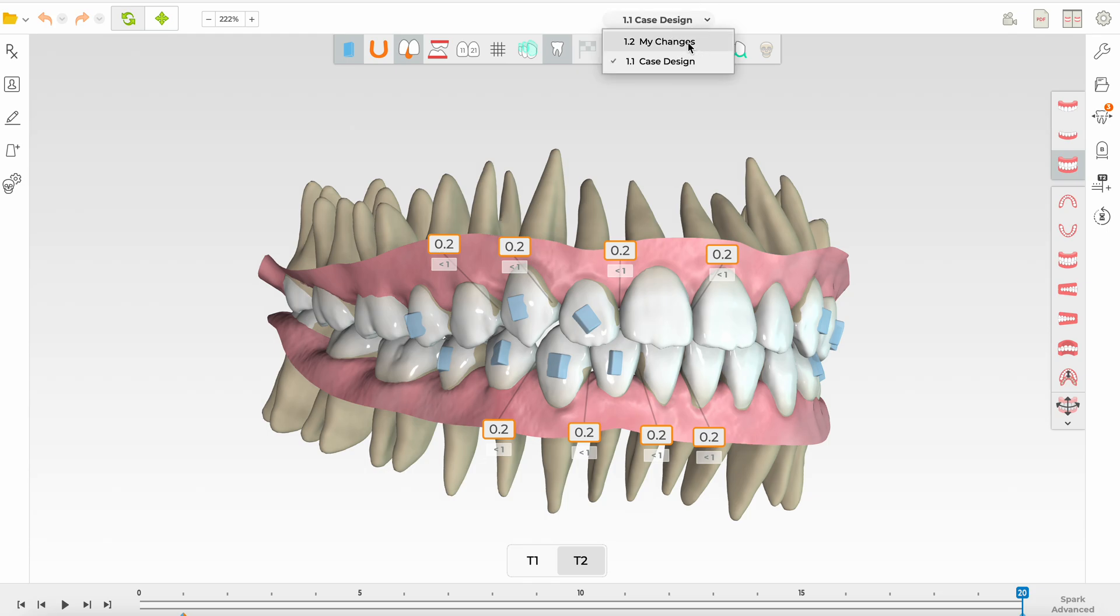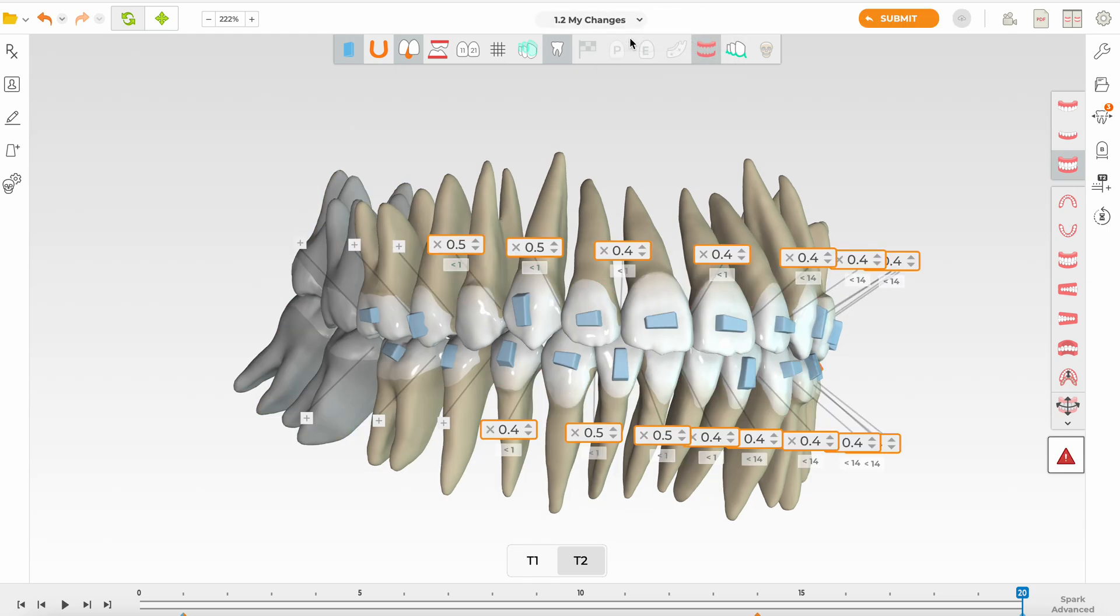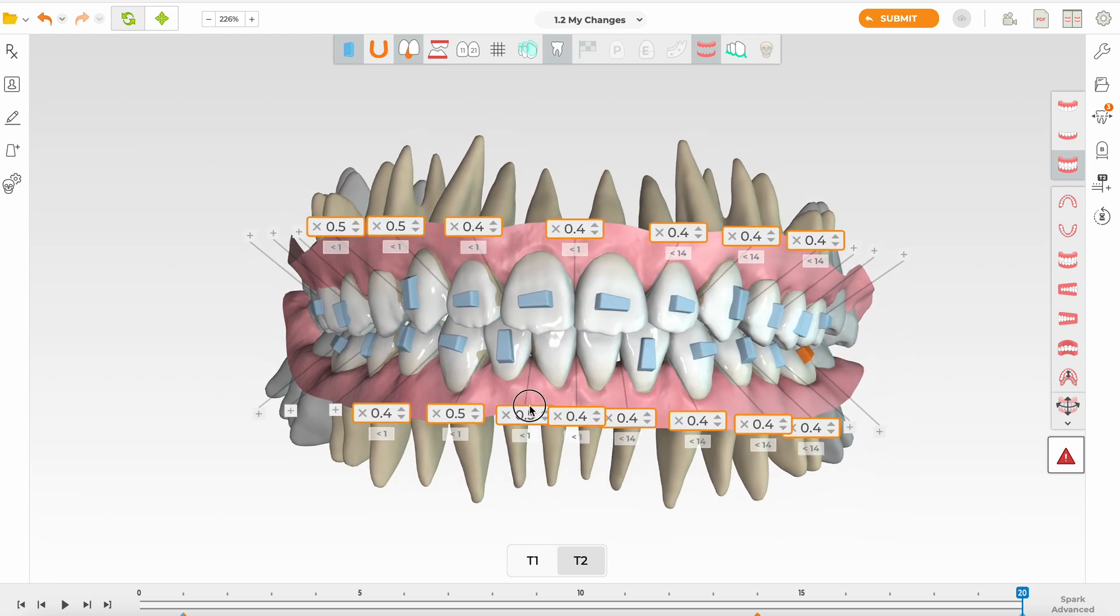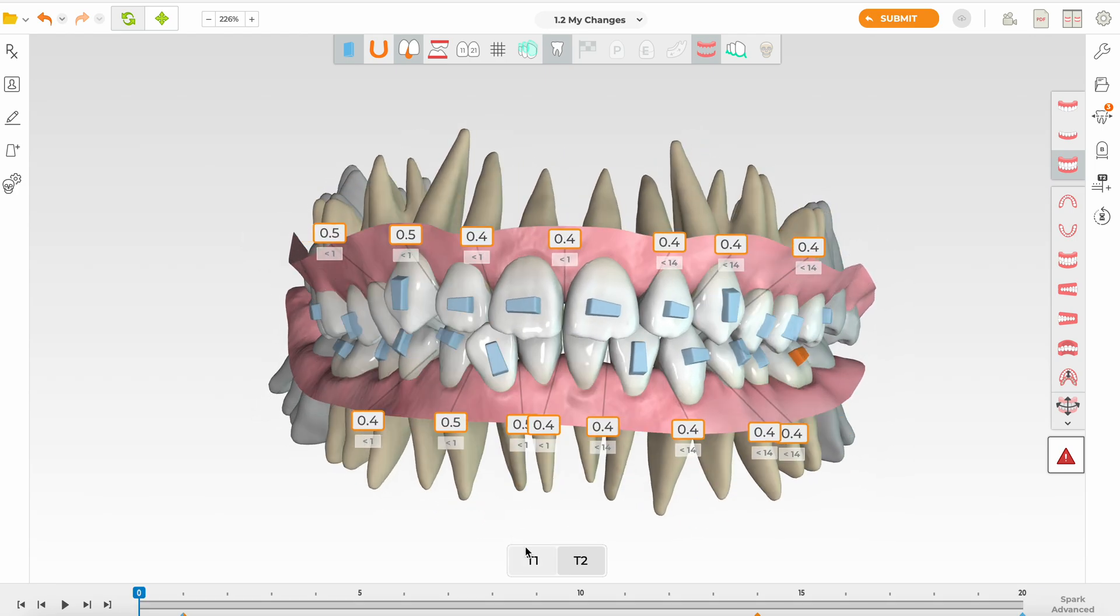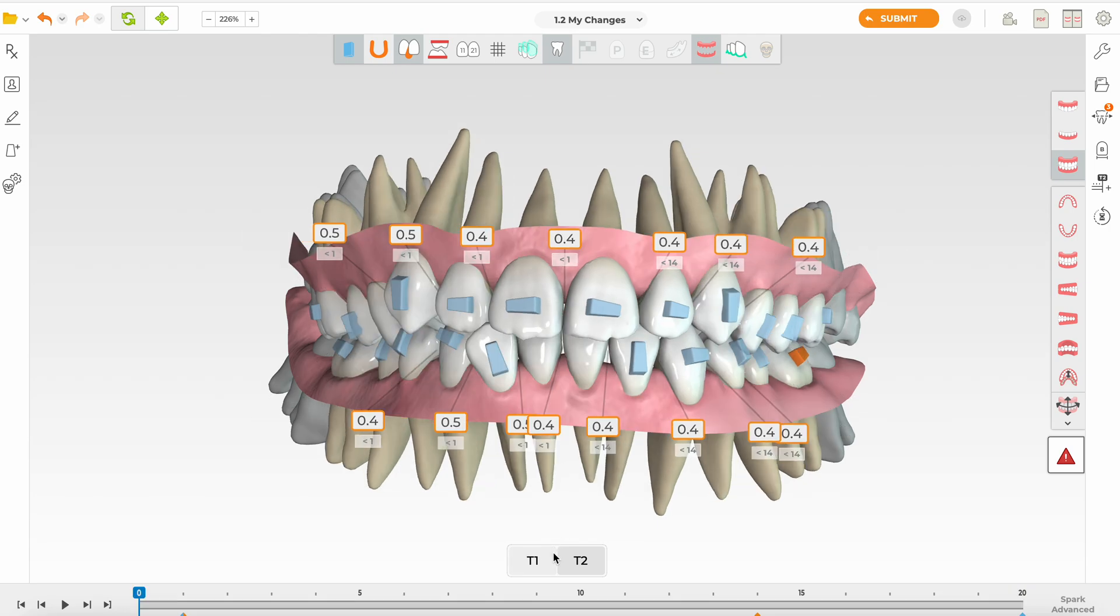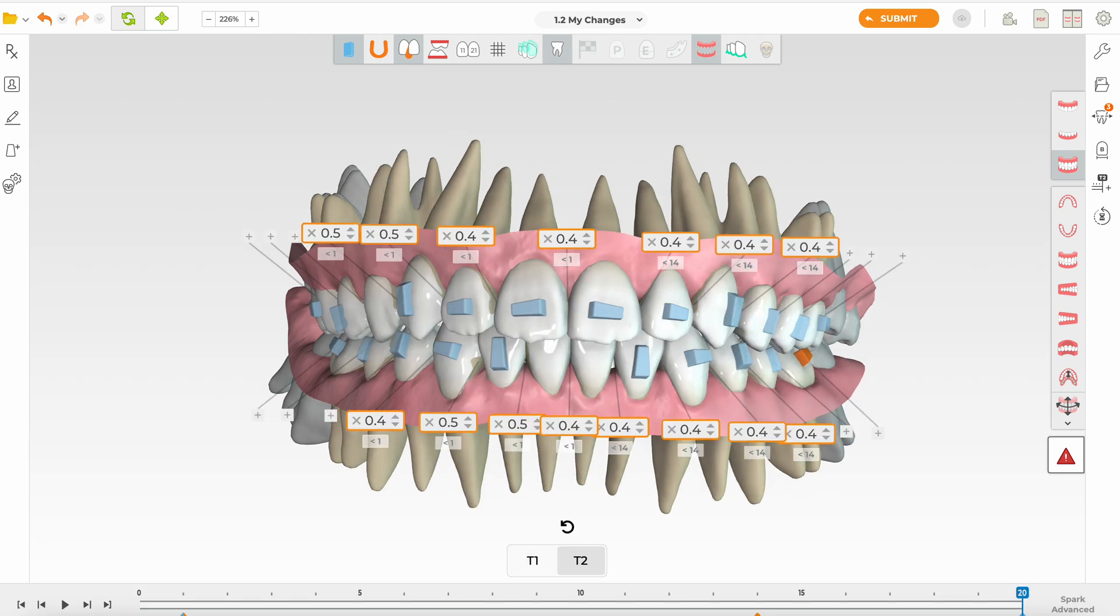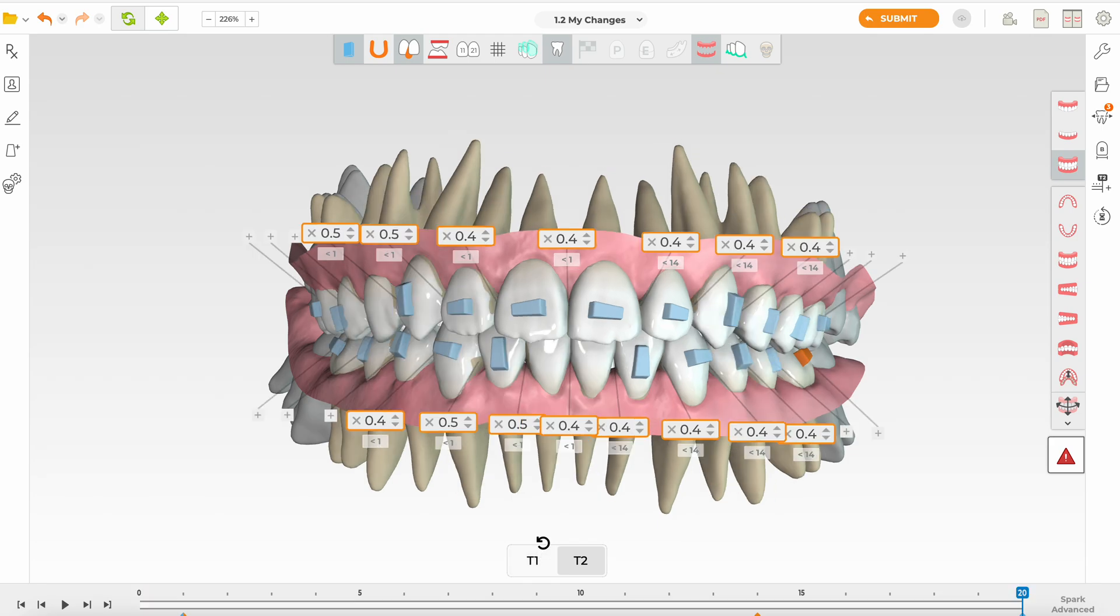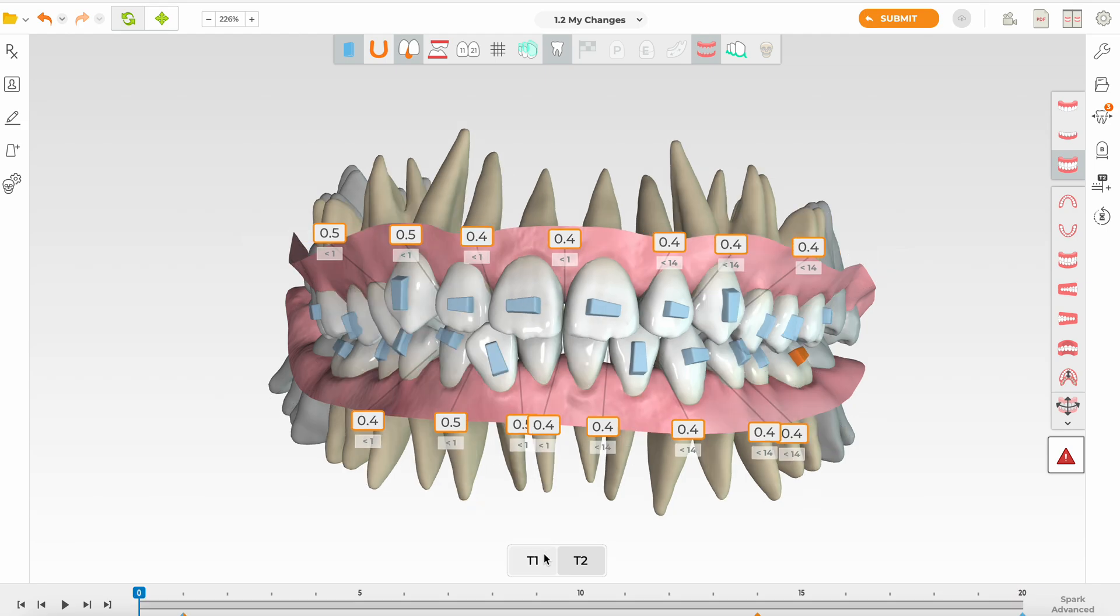These are the changes to my case design. I think a lot of the teeth were moving. If we look at your 12, 13, your 22, 23, look at the amount of rotations on them. Then your 42, which is your lower right lateral incisor, they're all moving incredible amounts.